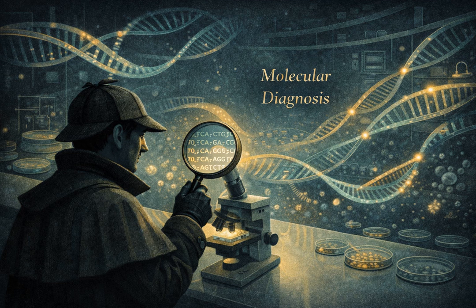Okay, that covers the thermal cycling methods, the dancers. But not all amplification needs a heater and a cooler. Let's talk about the isothermal engines, the ones that work at a single constant temperature. These are very clever. They use enzymatic tricks to amplify nucleic acids without the need for a thermal cycler machine. And the most important one clinically, the one that Joetz really highlights, is TMA, transcription-mediated amplification.